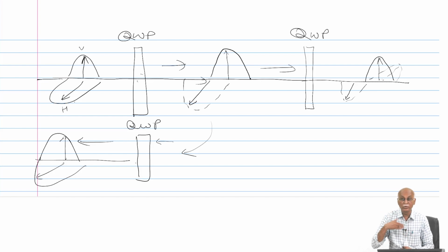We did not go into details of how to estimate such refractive index. We did not go into those aspects, but we have assumed that there are such birefringent materials which allow us to do this. When I am buying for my device, I am not going to design and fabricate the quarter wave plate, I will have to integrate it only, because so many components I cannot make. So, that is why I am not going into those details, but it is possible.